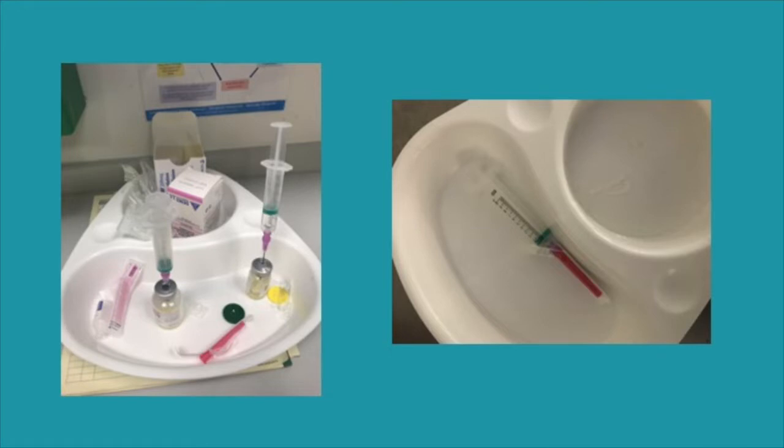Here we go. Here's a random IV in which I just walked onto a ward and I saw this. A couple of reasons why this is wrong. Number 1, who's the medication for? No idea. There's a drug chart underneath, but is it for that patient? I presume so. It's already signed for, so I could be quite nasty. I could contaminate this medication, already been signed for.